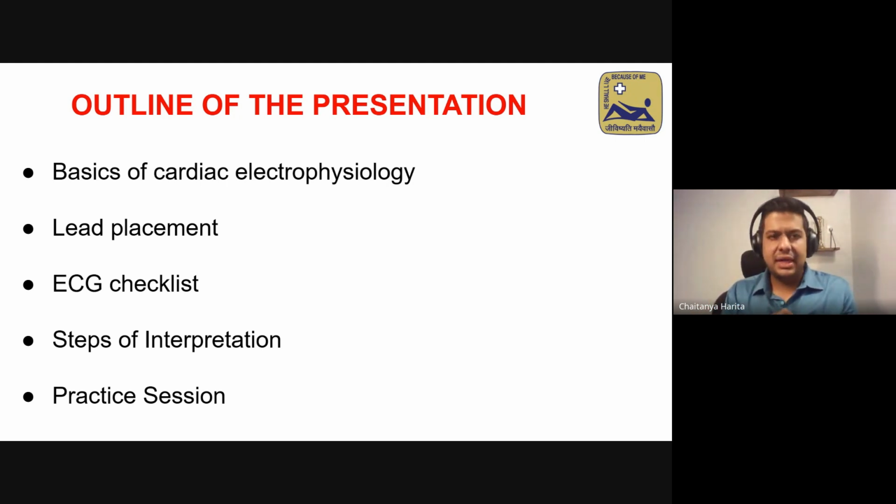How to place the leads, and this is very, very important because a lot of students work in centers where the ECG training may not have been as good for the staff. So it's important for lead placement because a lot of ECGs come to me where the lead placement is faulty and thereby a diagnosis is mismade, or misdiagnosed rather.